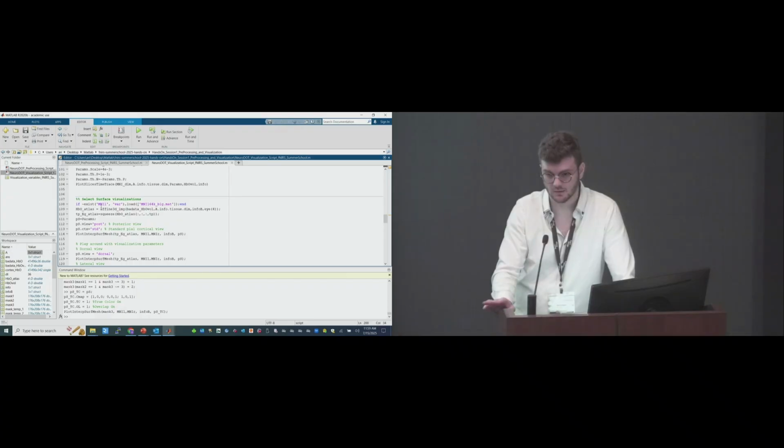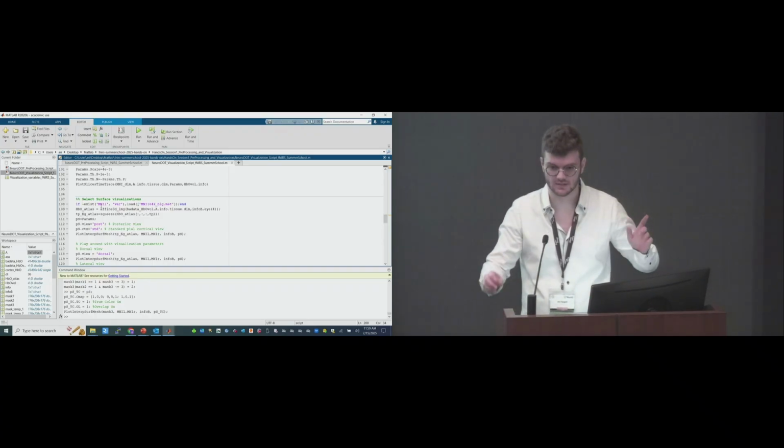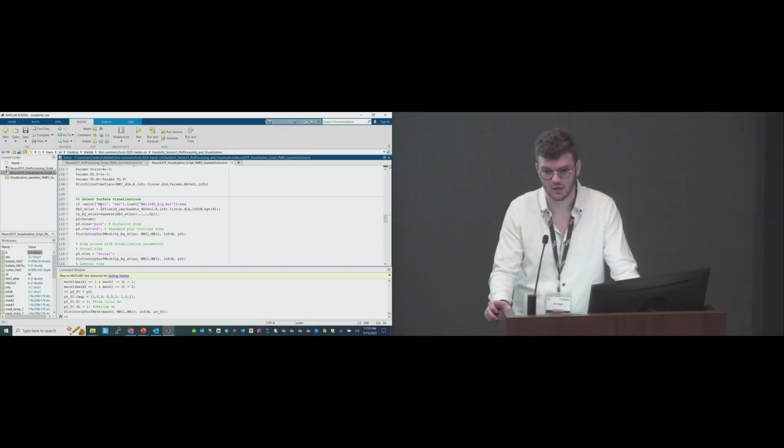Okay, and you have scripts for that? We have scripts for that. In the NeuroDOT toolbox, we have tutorials that are both MATLAB script and PowerPoint based, where you can run through them side by side. We have one for image reconstruction that will run through similar examples to Adam's slides earlier. If you want to play around with some data and practice with lambda 1, lambda 2, you can totally do that with our tutorials.